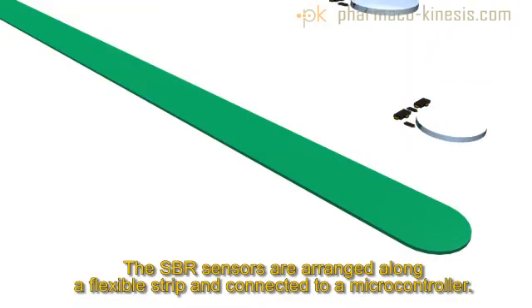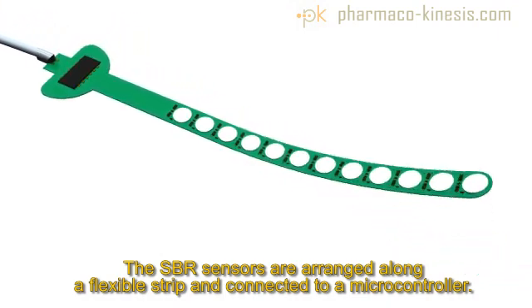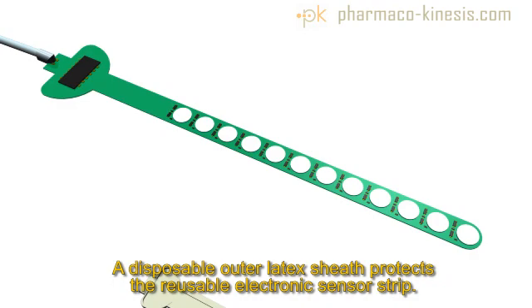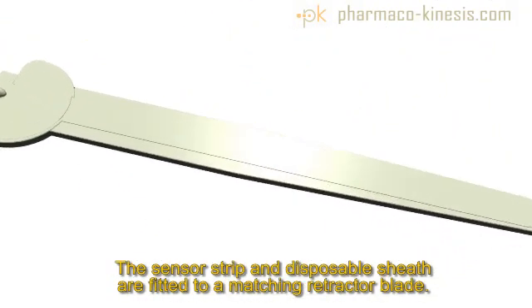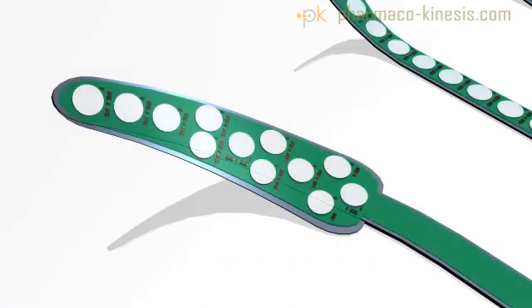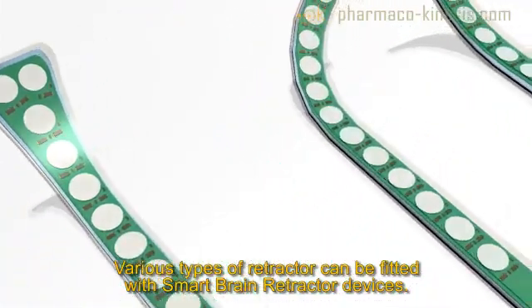The Smart Brain Retractor consists of an array of sensors mounted parallel on a pliable strip with an electronic microcontroller at the base, inserted into a disposable protective outer sheath. The sheath with sensor strip is fitted to a matching retractor blade. Particular variations of the basic design can accommodate the many common types of surgical brain retractors used today.